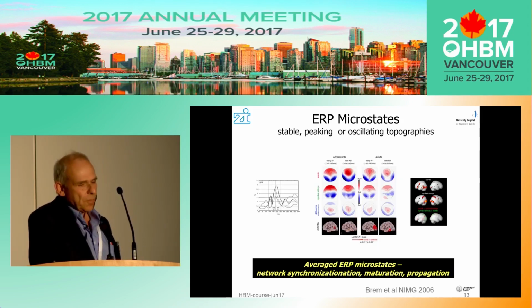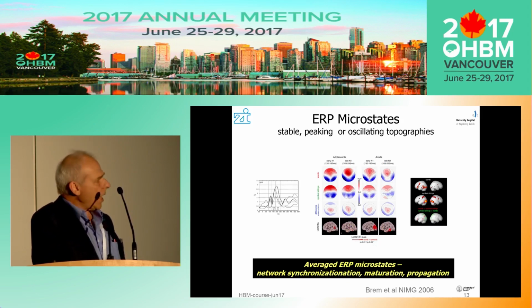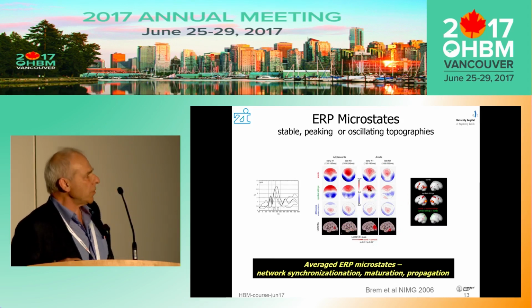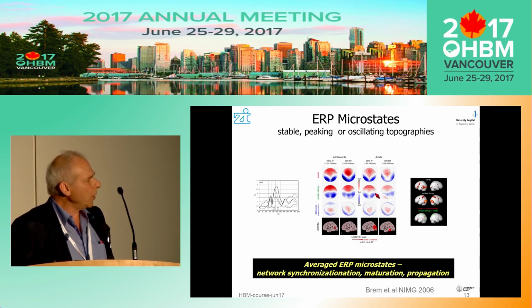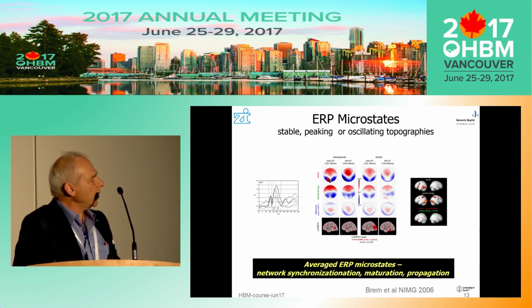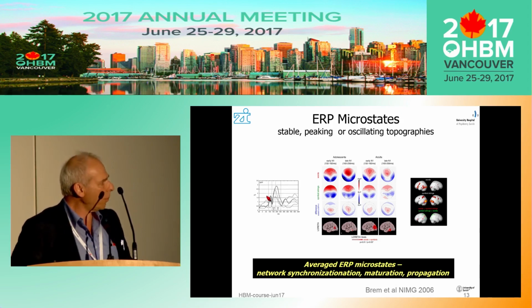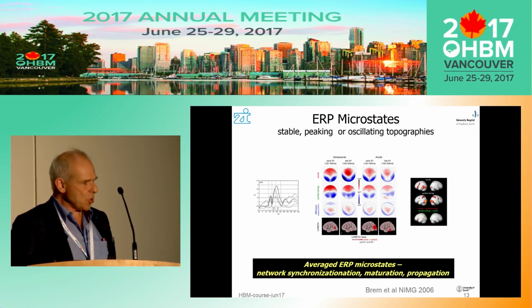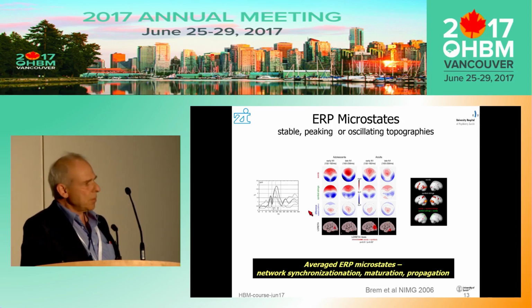This is shown here in this one slide where we had a source localization showing you essentially bilateral activation patterns. If we just look at the subtle part of the activation pattern, that is only found in one stimulus category, namely in words, what you can see is the propagation within a very short time period in two successive microstates, both within the N1 component time range. Essentially we show here only the left hemisphere, which shows the differences between a word and a symbol condition.